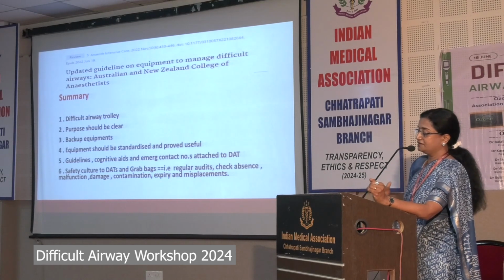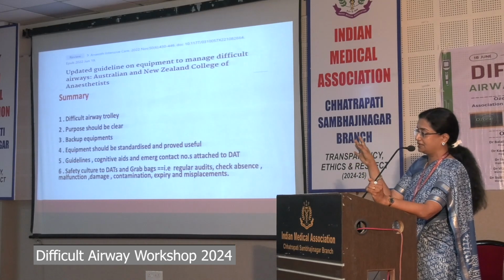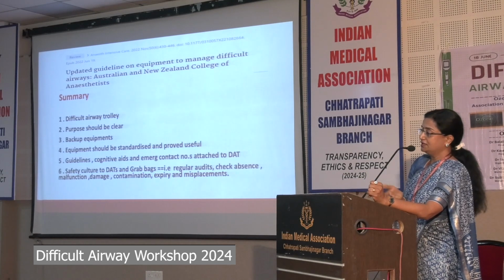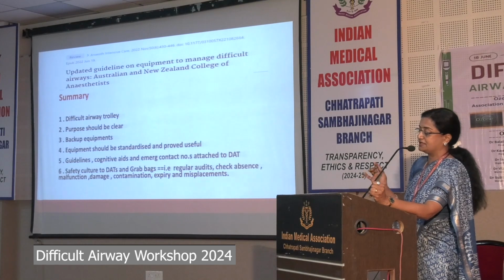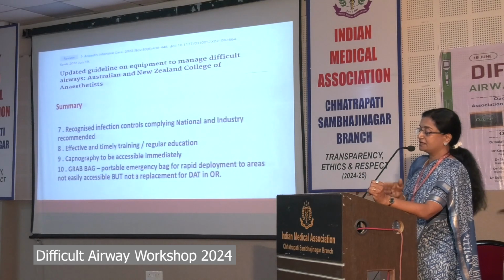The guidelines, cognitive aids, and emergency contact numbers should be readably written, laminated and attached to your difficult airway cart. Safety culture applies to the difficult airway trolley and grab bags. Like a freelancer carries his own bag, you should have a regular audit. Check for absence, malfunction, damage, contamination, expiry and misplacement, and do the needful.